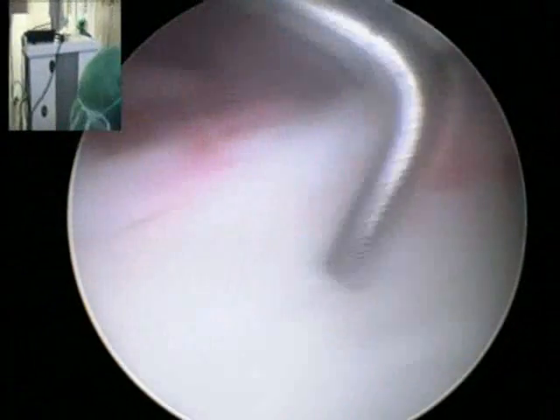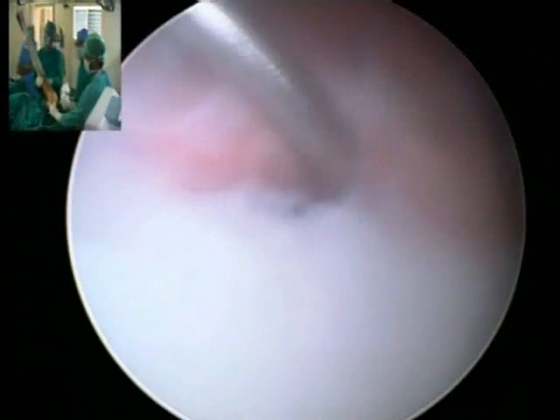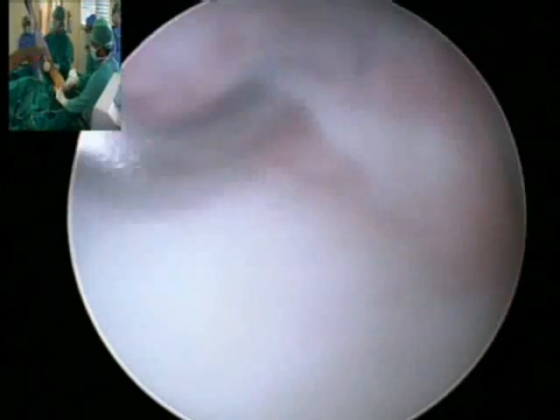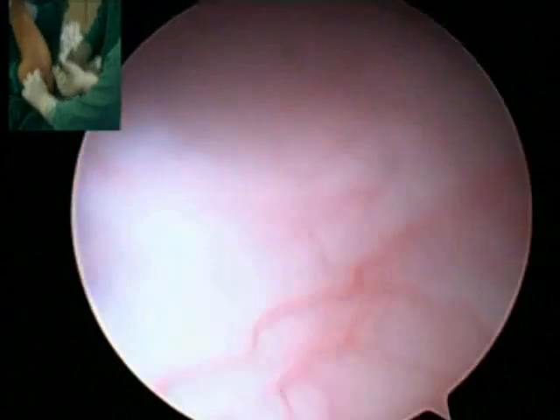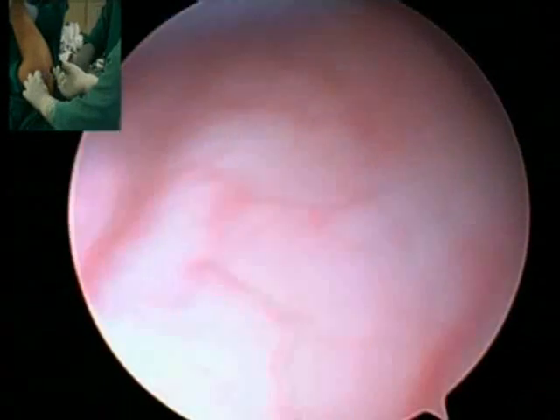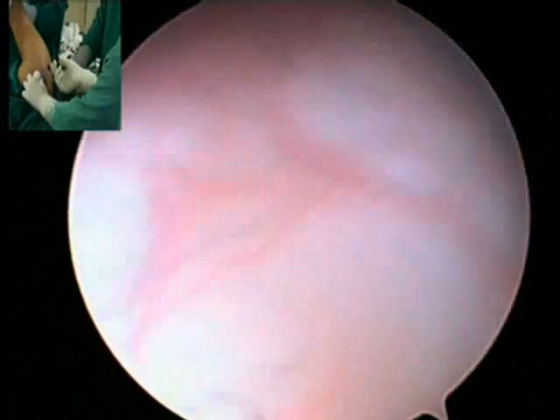Right. And he has a very benign kind of soft tissue lesion here. Yeah, that's very well demonstrated. I don't think he needs any further mobilization than what I have already achieved. Can you lift this a little bit, please? He is fairly easy to get through to the 6 o'clock position there, so he is slightly loose.